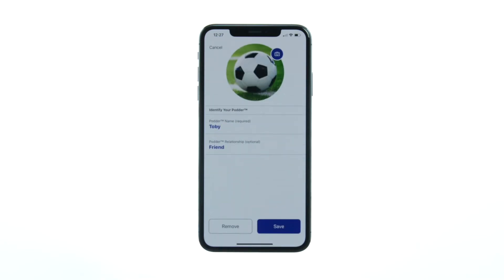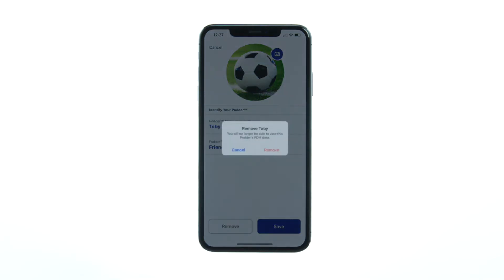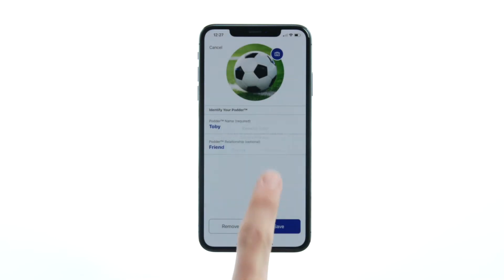While in the screen, tap the Remove button. This will trigger a confirmation window. Tap Remove to complete the process.